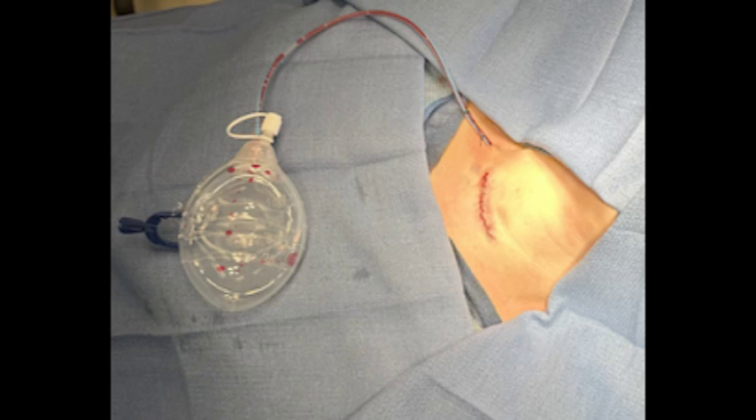Here's a drain that's been placed in the wound. You can see the tubing exits away from the incision and leads to the bulb.